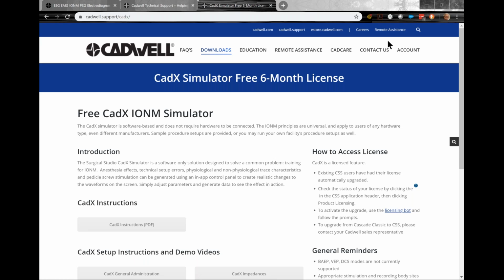I don't know what you think, John, but if this is the same procedure file you've used before, I'm not sure I have an answer. Generally, it could be you've got more than 32 channels in use. If this wasn't made specifically in Surgical Studio, sometimes when you export out of Classic and import into Surgical Studio, the multiple tests functionality is a little tricky to take care of, so you do have to verify that. It almost sounds like you had too many channels in use at one time. Do you have any opinion on that, John?